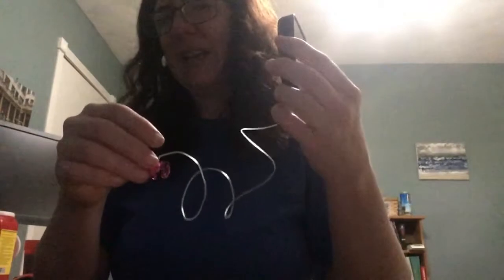Okay. Make sure the set is disconnected from your body. Obviously it is. Press next to fill your tubing with insulin. Fill tubing. Now, for this bit, it usually takes about 11 to 13 units of insulin, depending on the day, to get through. You want to wait till you see 3 drops going through this bit. And regardless of whether you have the set attached to you or not, you want to hold this needle end down. And the reason for that is insulin can get a bit goopy.